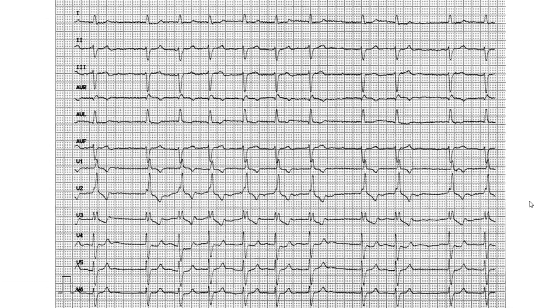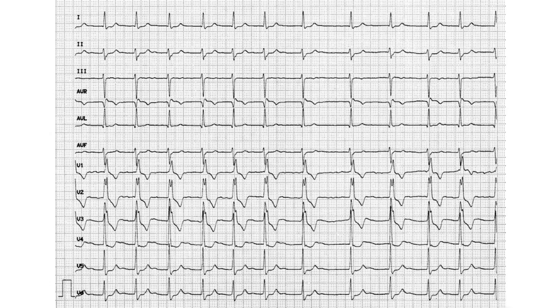Okay, next question. Just glancing through it here because I think the main idea has reached you. I'm just making sure that we cover all of these to make sure that there's no hidden idea in any of these examples. Question 30. This is question 30. 3, 2, 1. Okay.